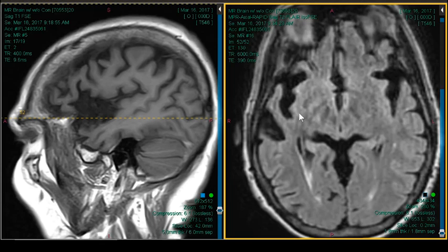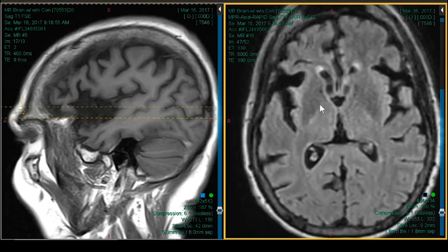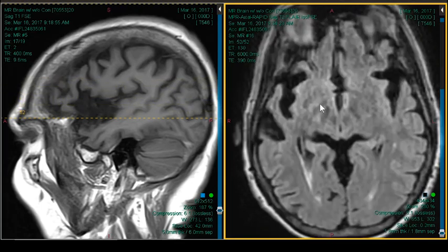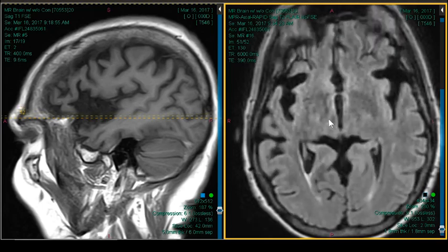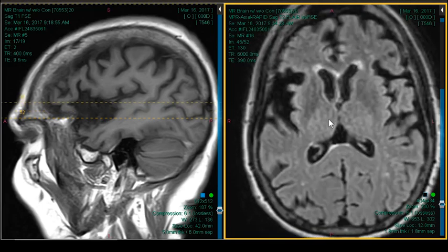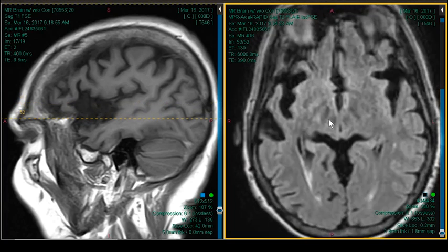Parkinson's disease is only going to have this degree of atrophy very late. It's not going to be frontal predominant. LBD, Lewy body dementia, really has a non-specific, I hate to use that word, a non-specific pattern of atrophy. The key to that diagnosis is the Parkinsonian clinical features and the visual and occasionally auditory hallucinations. So there you have to really use the clinical to assist you.